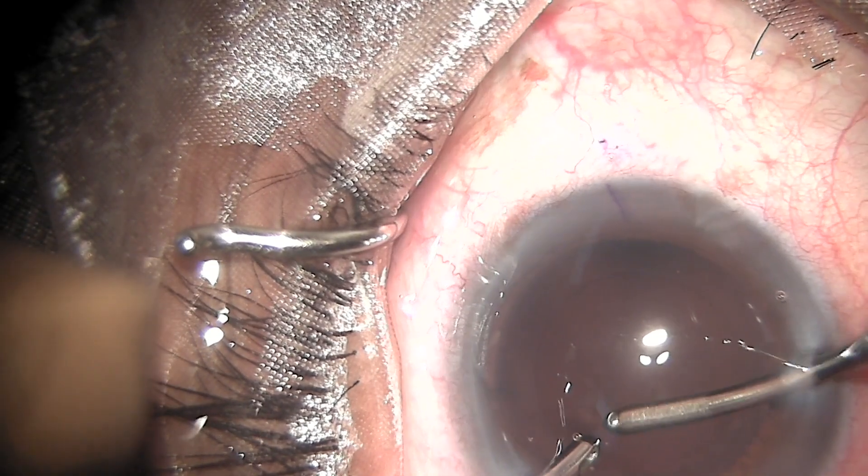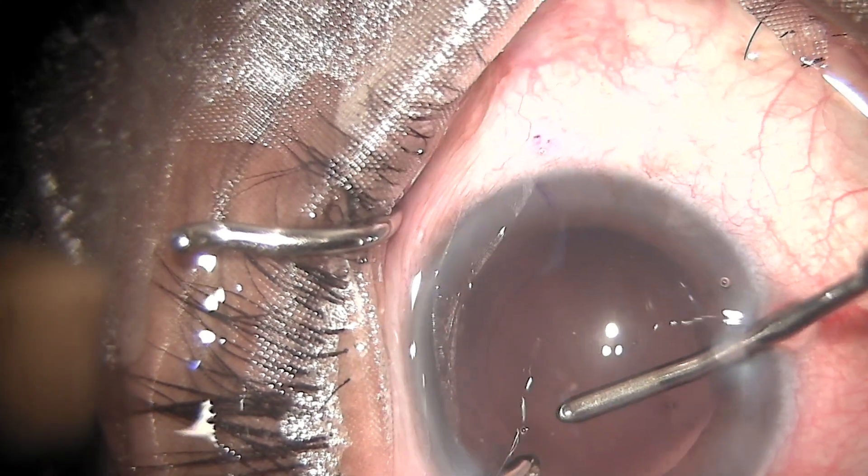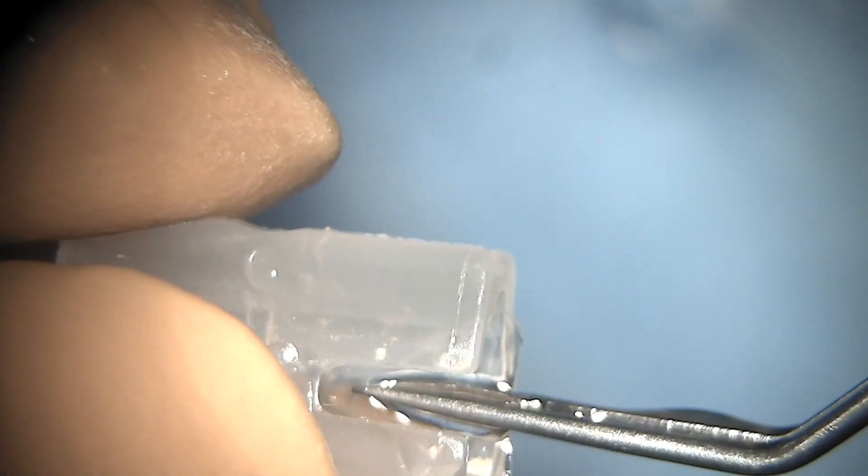Here you can see that some cortex is sticky and stuck to the posterior capsule, which I am peeling off. You can see I have successfully done that and the capsule is clean.